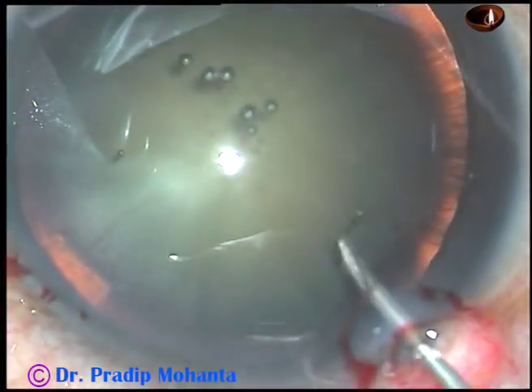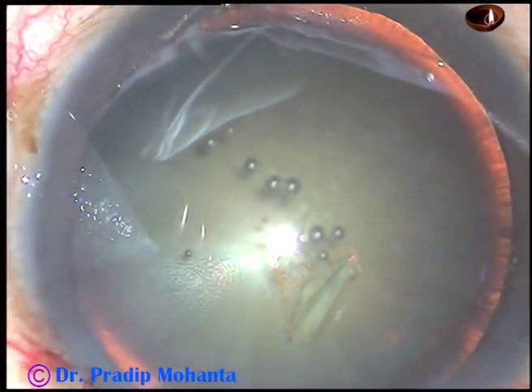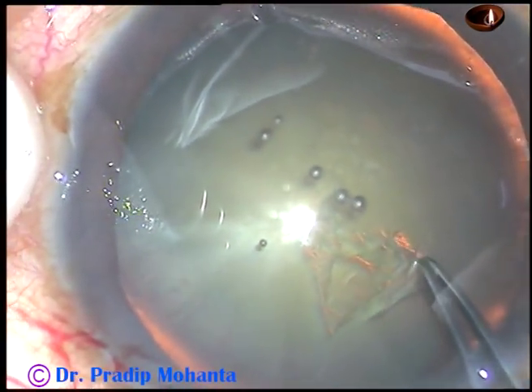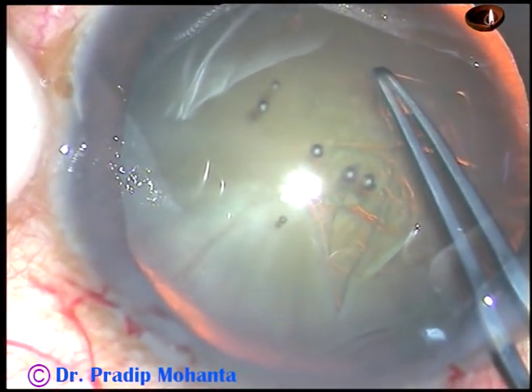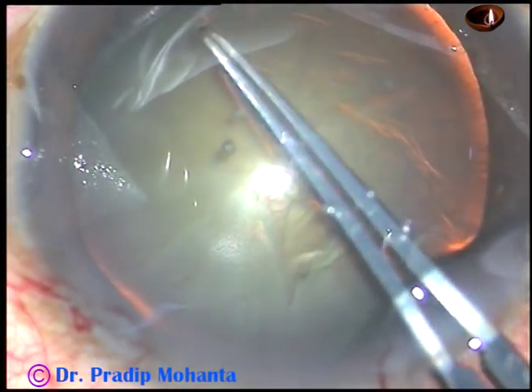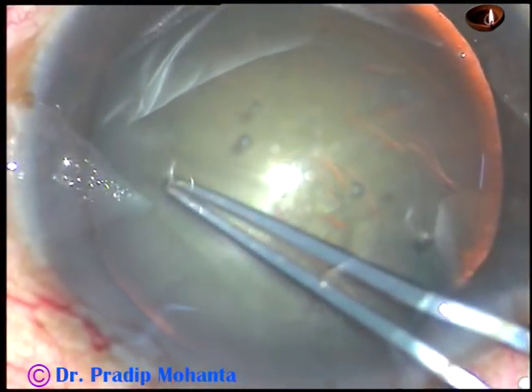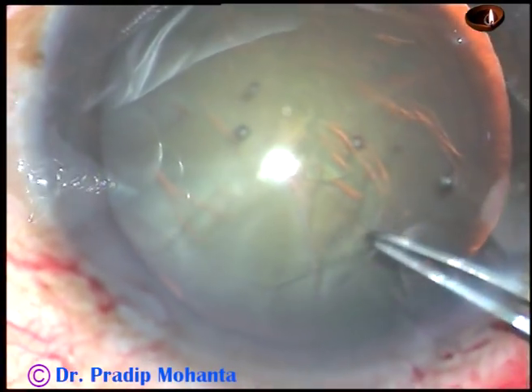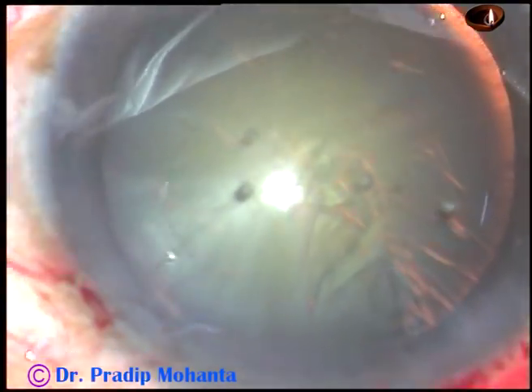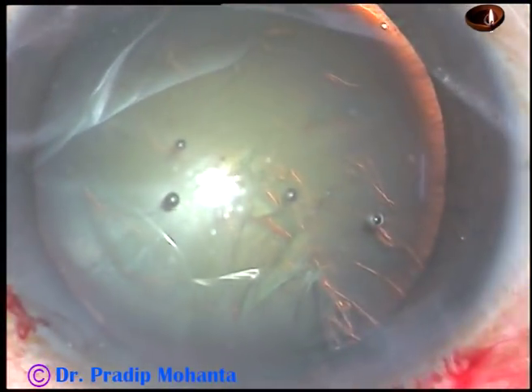Capsular rhexis is done. The anterior capsule has been incised and the capsular tag has been raised. I hold this capsular tag with utrata forceps, going anti-clockwise all around, remaining at a certain distance away from the margin of the dilated pupil, and I complete the rhexis which is quite round.